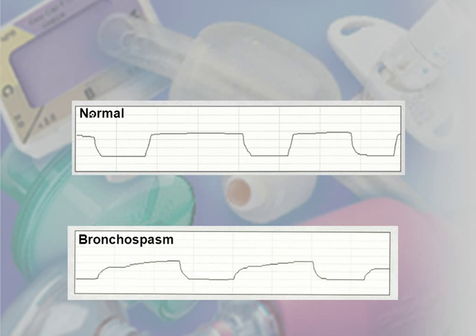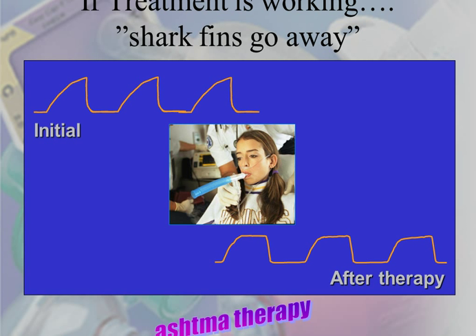So here's the normal capnography waveform on top, and then the bottom is that bronchospasm for somebody with asthma, COPD, and so on and so forth. That's obviously exaggerated, the initial versus the after therapy.